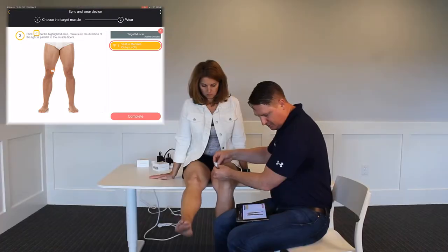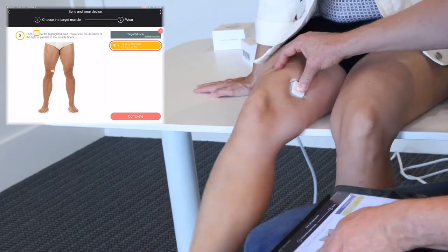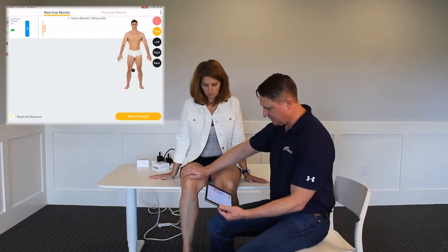It says connected. I'm aligning it longitudinally with the length of the muscle, and now that is complete. I'll push down to make sure it's connected well.